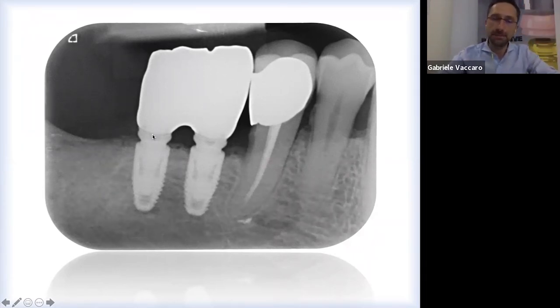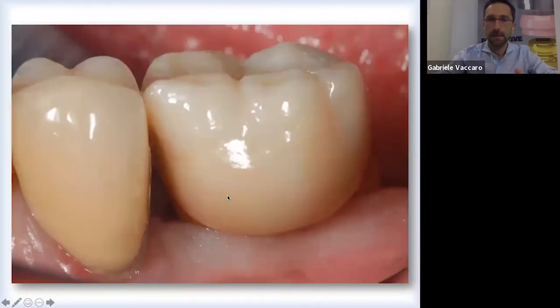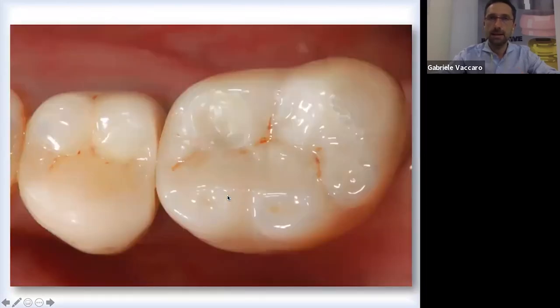And then in the permanent teeth, in the definitive one, we can see everything we talked about, the abutment one time, the switch platform system. And this is the job finished.